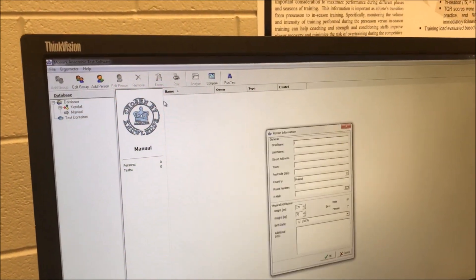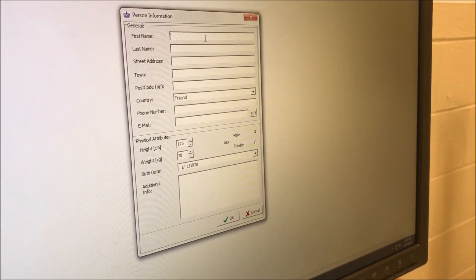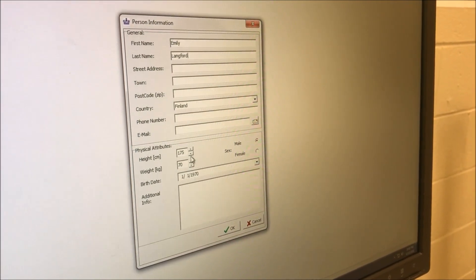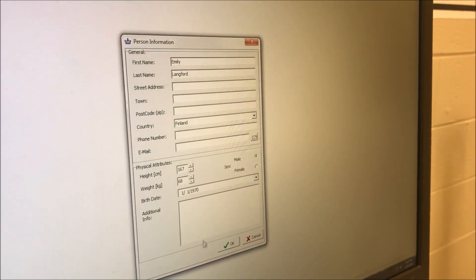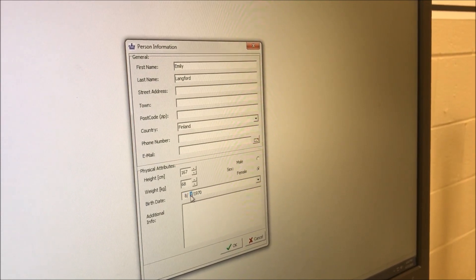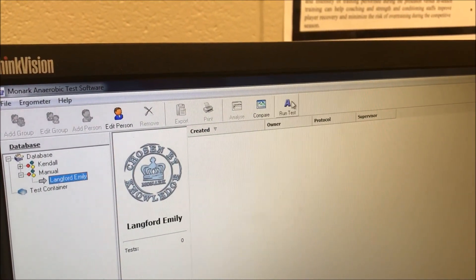I will then add a person — this person will be the test subject. Because I will be performing this test, I'm going to enter my information. I will drop my height and my weight down to match accordingly. I'm a female, and I will enter my birthday. From here, I'm going to hit Run Test.